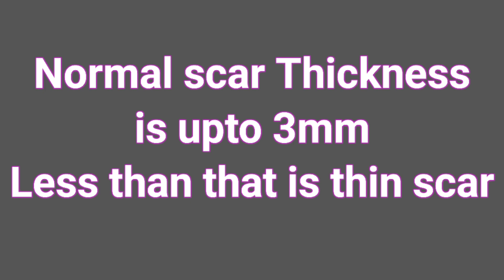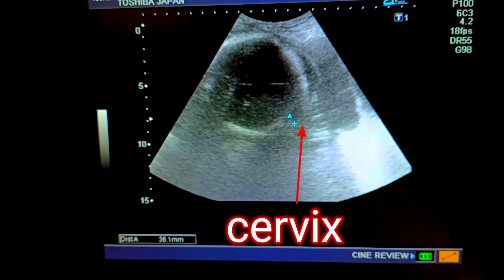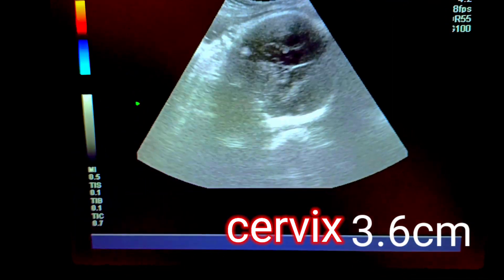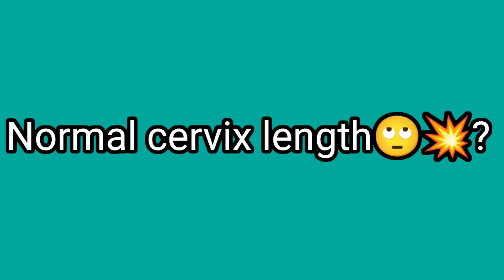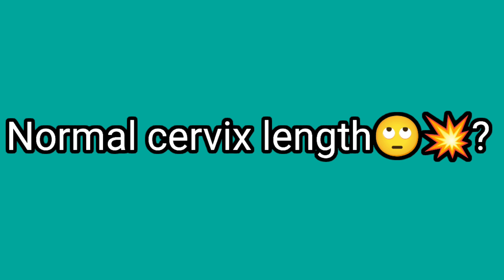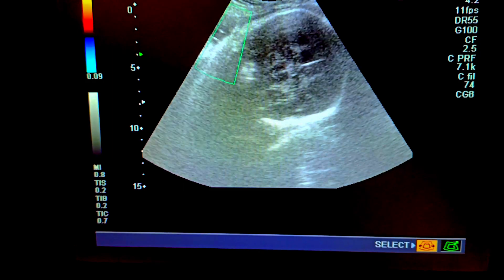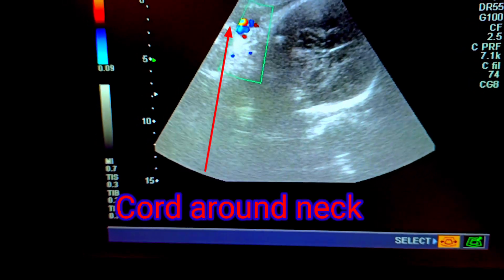Normal scar thickness is up to 3 millimeters. If it is less than that, it is called a thin scar, which may cause pain in the lower abdomen before 37 weeks of pregnancy. Cervical length is about 3.6 centimeters. You should be able to find out the cervical length — that is very important — and you should know the normal cervix length as well.